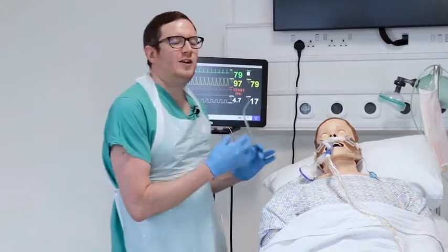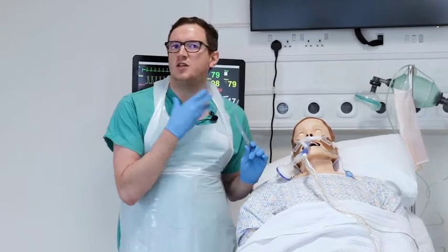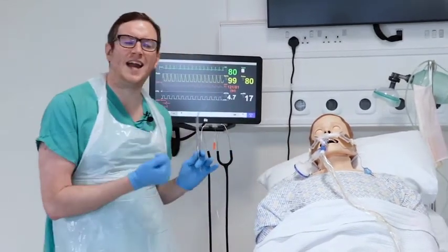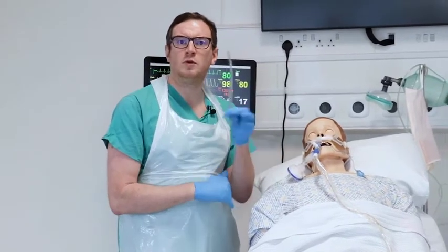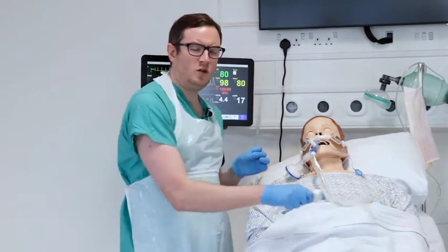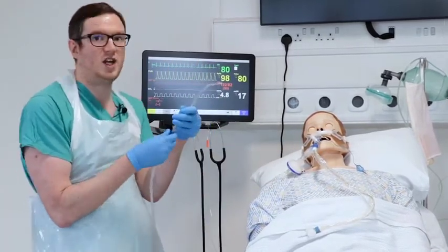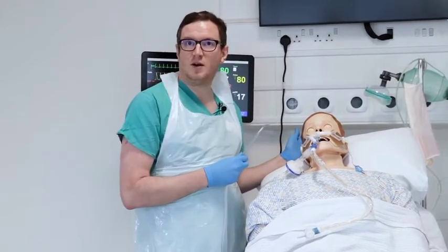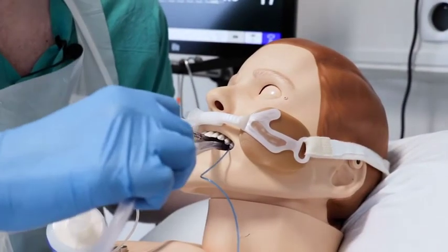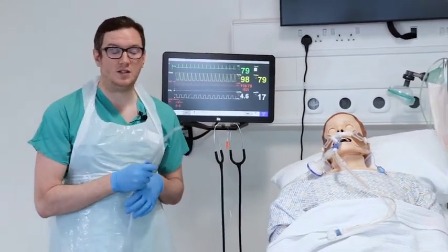Despite having an endotracheal tube in place, some patients will manage to cough past the cuff, and secretions may reach the upper respiratory tract and mouth. Since the inline method only suctions through the lumen of the ET tube, use a Yankauer suction device for any secretions that reach the mouth. Connect the Yankauer to the same suction source used for inline suction and assess the patient's mouth, focusing on the side the patient's head is facing, where secretions tend to collect.